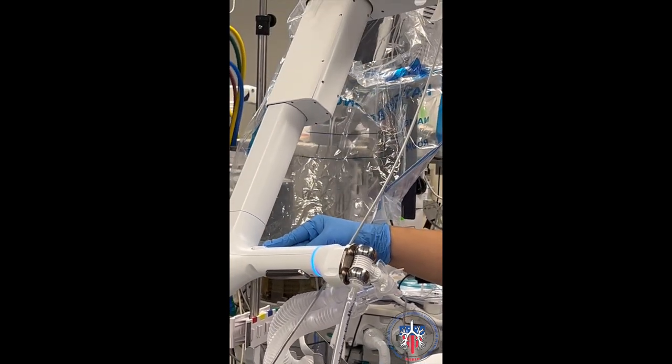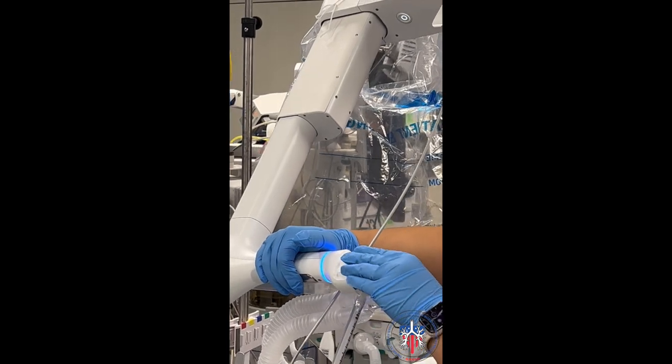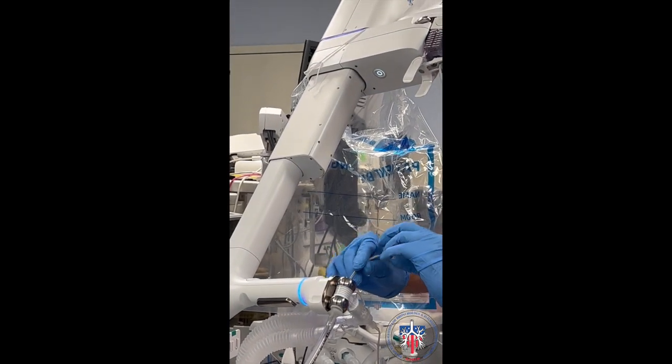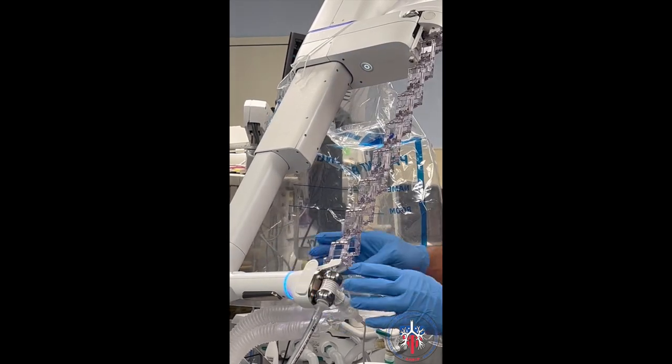The robotic arm is lowered for easy system access. A silicone-based lubricant is used to lubricate the catheter beforehand. The lubricated catheter is then inserted into the ET tube. Finally, extend the catheter guide on the system arm and secure it in place.